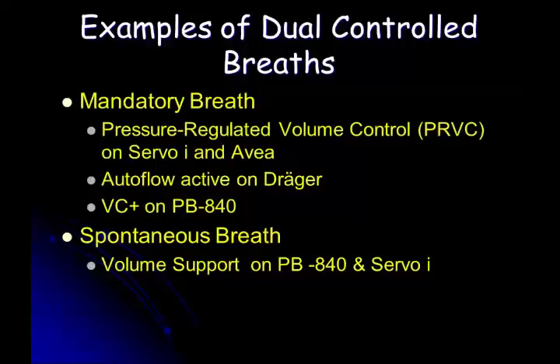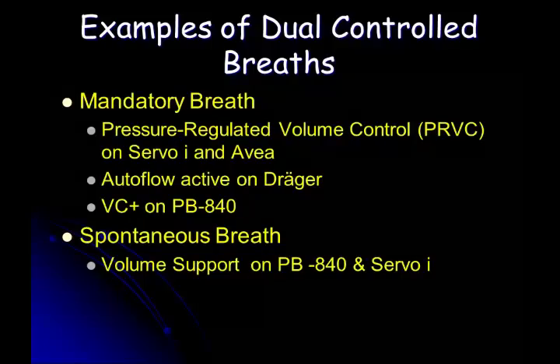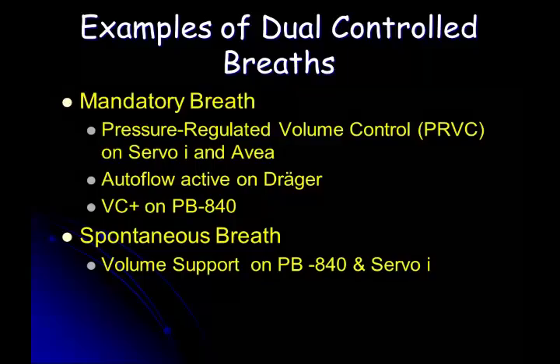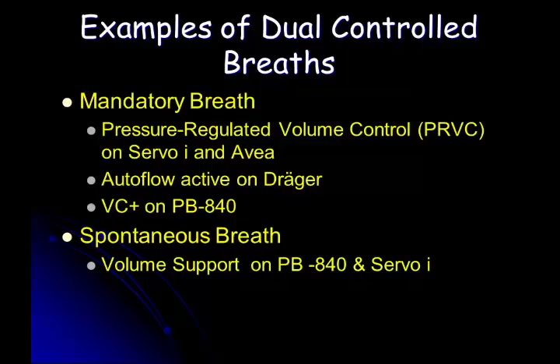And these are the examples of what we can do. These three are exactly the same concepts. Pressure regulated volume control. Autoflow, VC+.